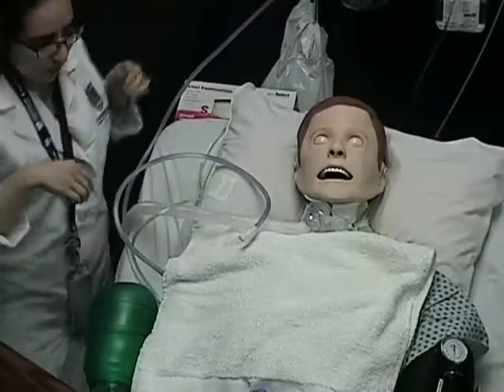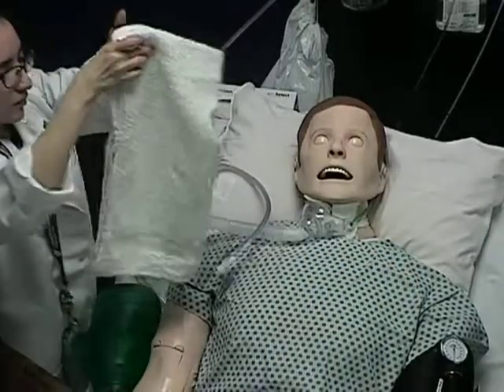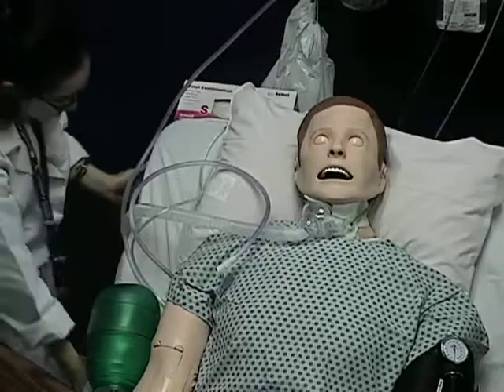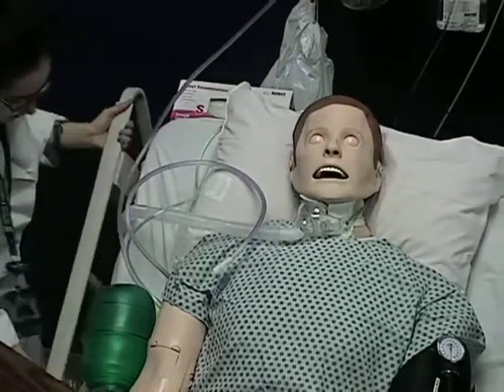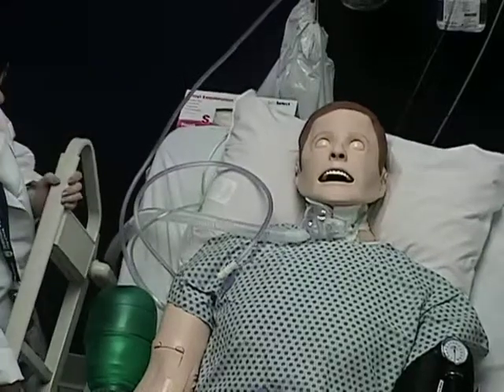Remove towel and place in laundry. And after doing so, reposition patient and make the patient comfortable. You have now completed trach suctioning.